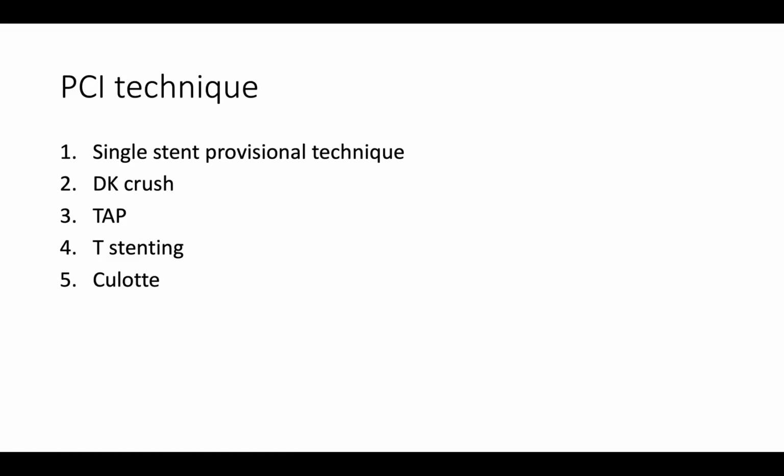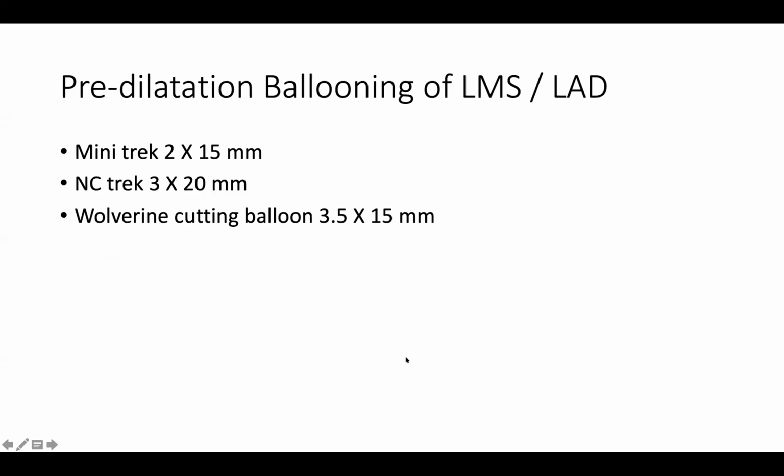Yeah. So if your two-stent technique is DK crush, then you should do that. If it's culotte, then you should probably do that. But if you're going with the data in left main stem, you would probably think about certainly doing a DK crush, because the DK crush 5 study showed it was better than provisional, and DK crush 3 study showed it was better than culotte stenting. Yeah, I think the other thing obviously is left main is a different bifurcation compared to the distal bifurcations.